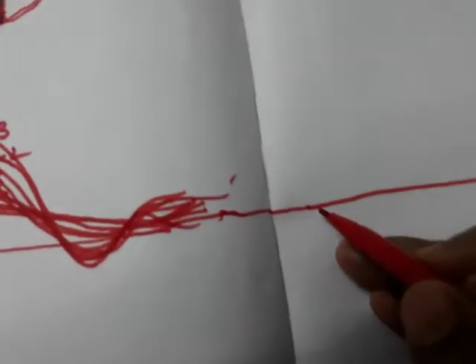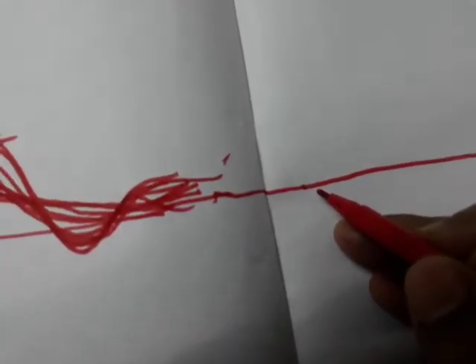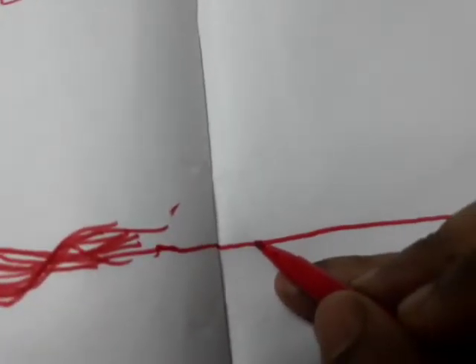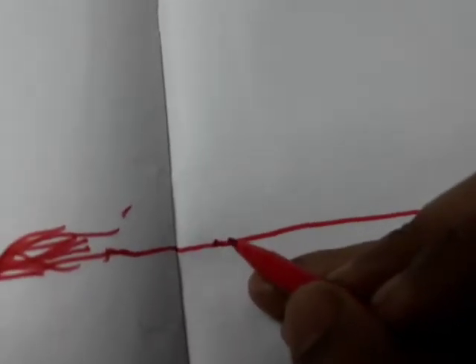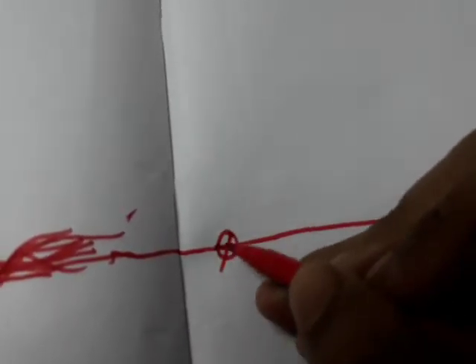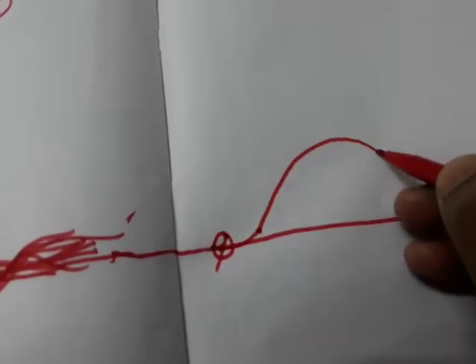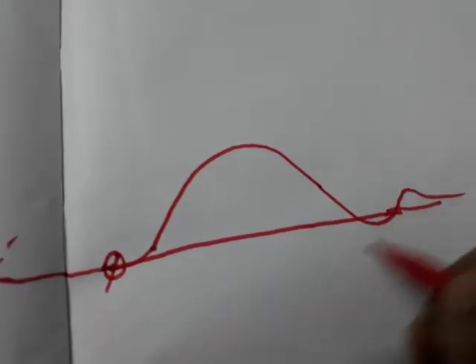We'll keep the baseline same. Okay, and we will now again stimulate this muscle directly. When we have stimulated, suppose this is the point of stimulation, we will see that we have got a good contraction. Something like this.